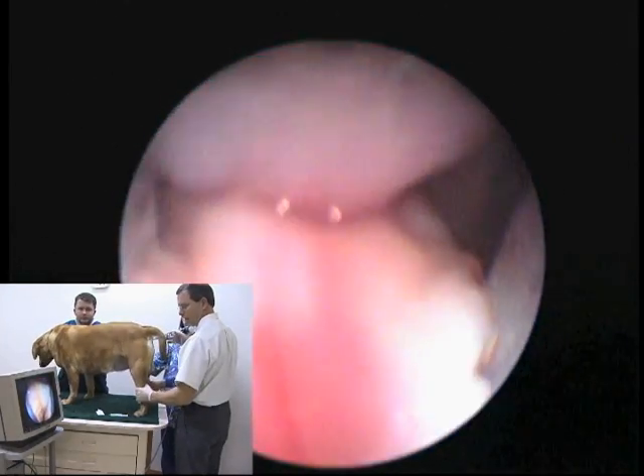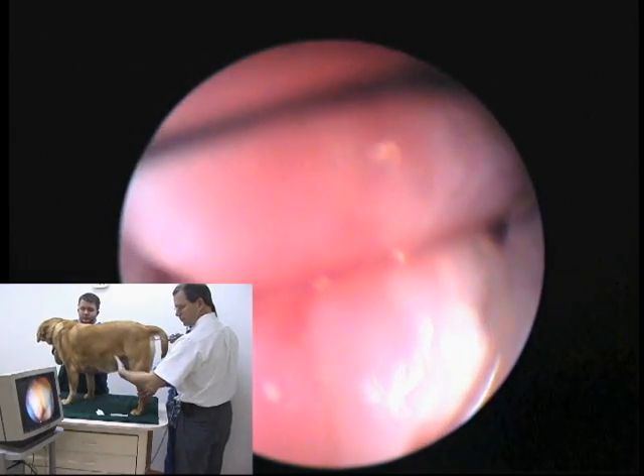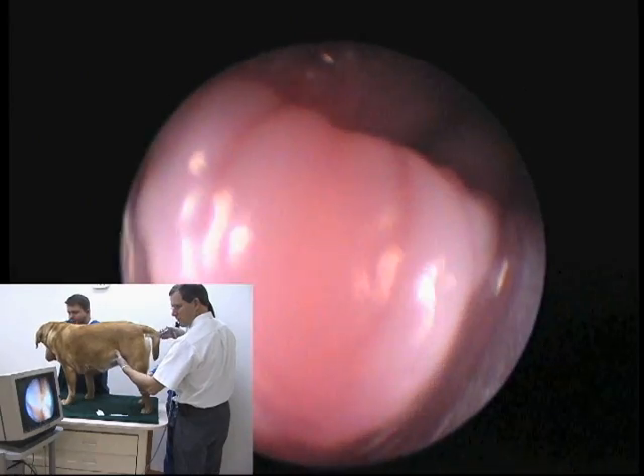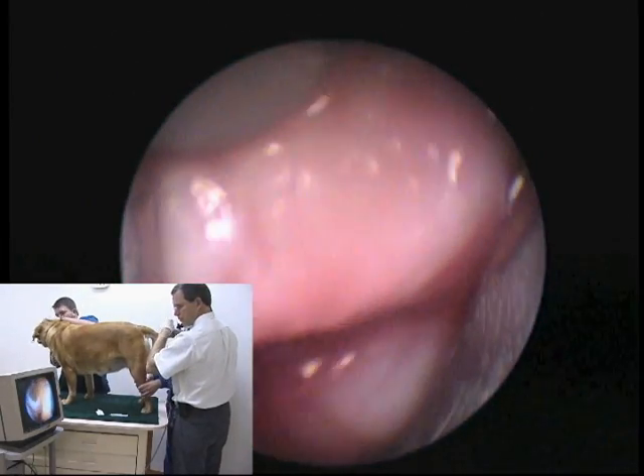As we advance the scope in, there is a fold dorsally called the dorsal median fold. As we go down that fold, we'll see that we just have this one fold and then there will be a large fissure. That fissure is the start of the cervix that we're just going by in that picture.